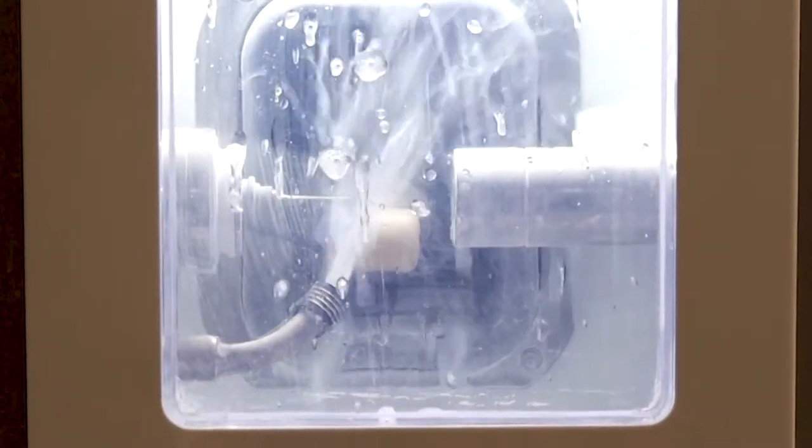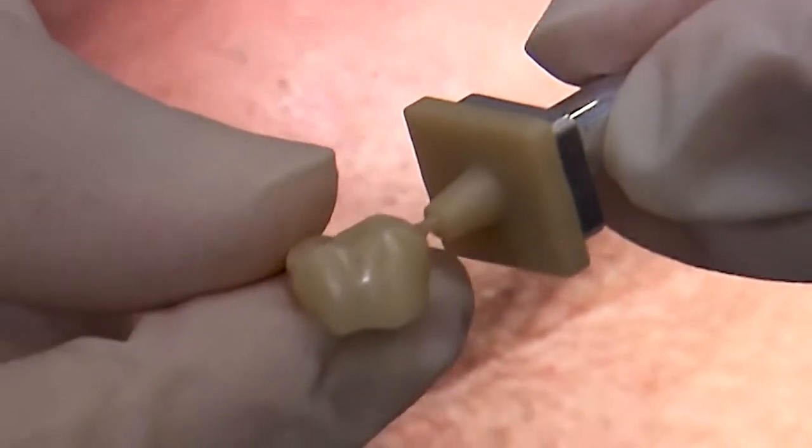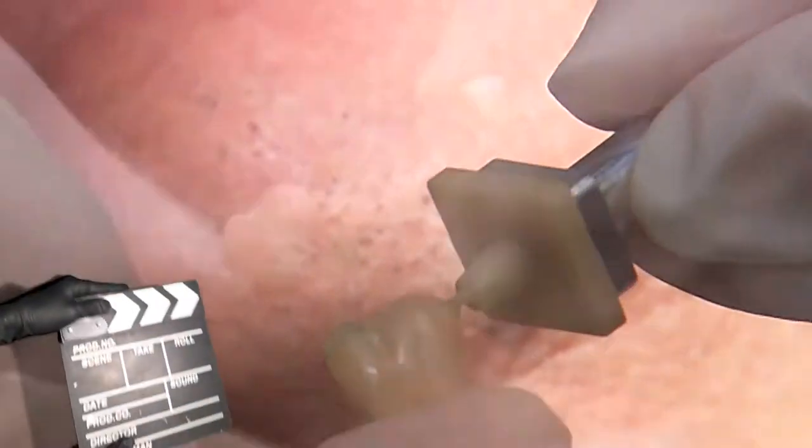When the design is complete, how does a 35-minute turnaround time for a fully sintered Bruxer Crown sound?